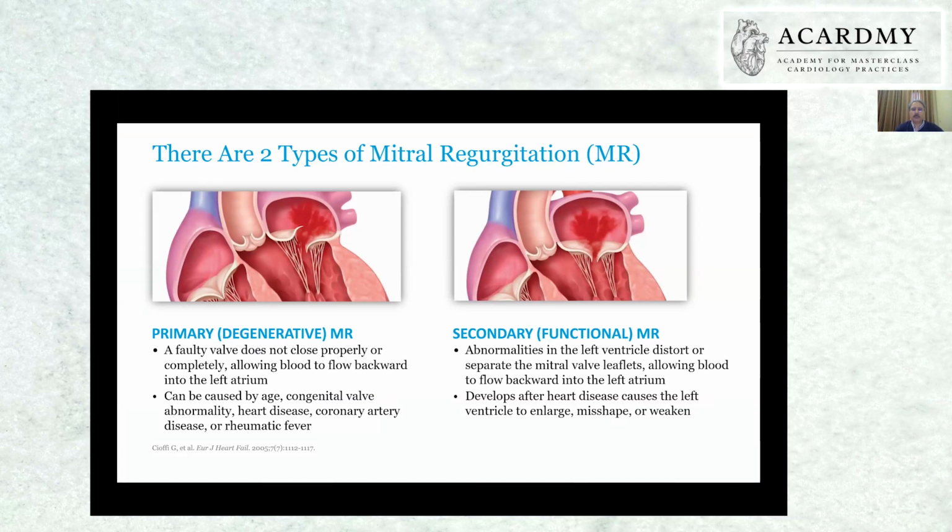We all know there are two types of MR where Mitraclip can be considered or planned. It's a primary degenerative MR, which is either flail mitral valve leaflets or prolapsing mitral valve leaflets. So this is one area. And then we have a secondary functional MR because of tenting or tethering of the valve leaflets because of a dilated annulus or dilated LV cavity. That is another area, where it's secondary to ischemic cardiomyopathy or dilated cardiomyopathy. There is a gross MR. So these two MRs can be attempted with Mitraclip.